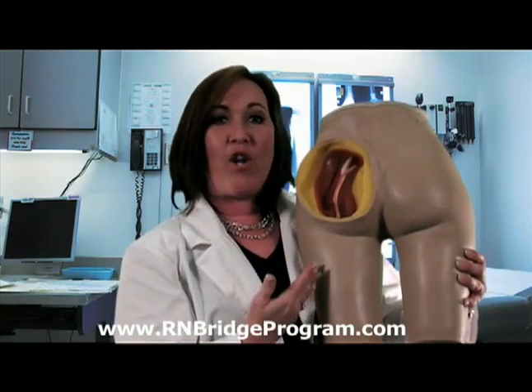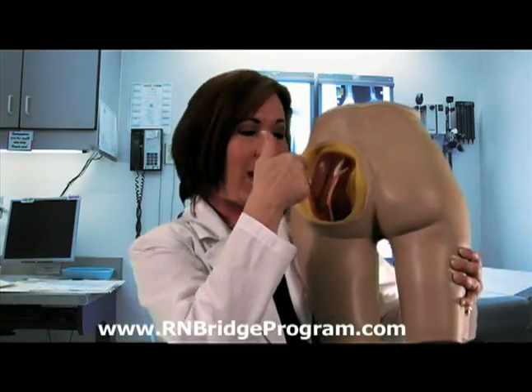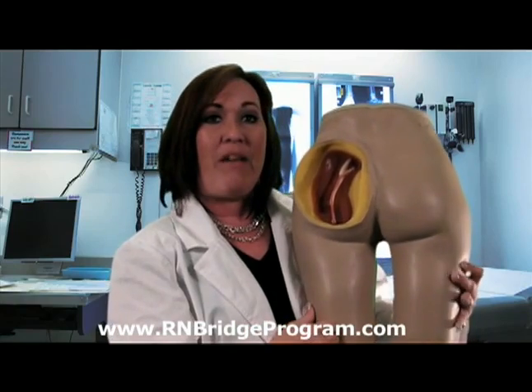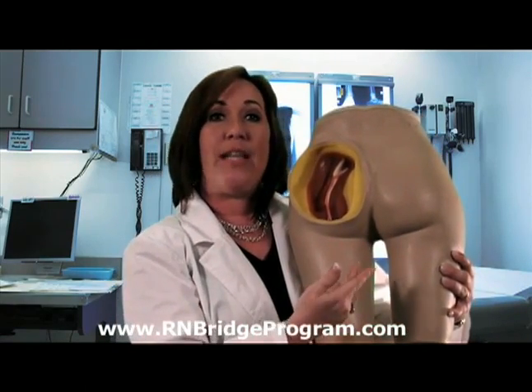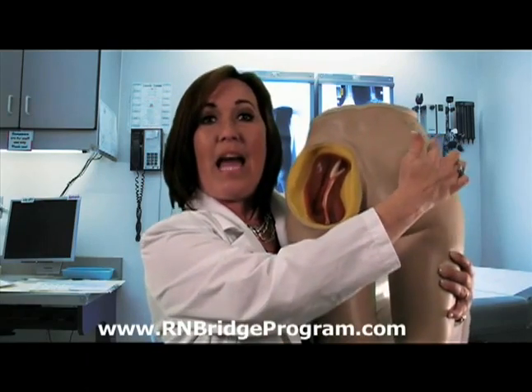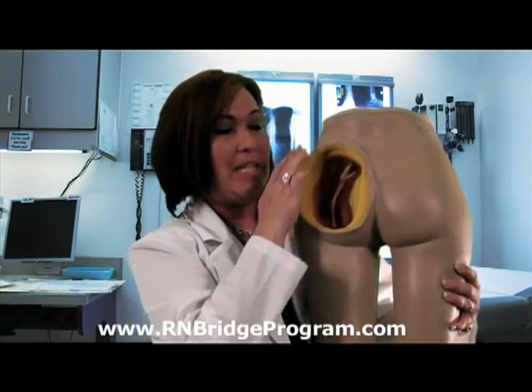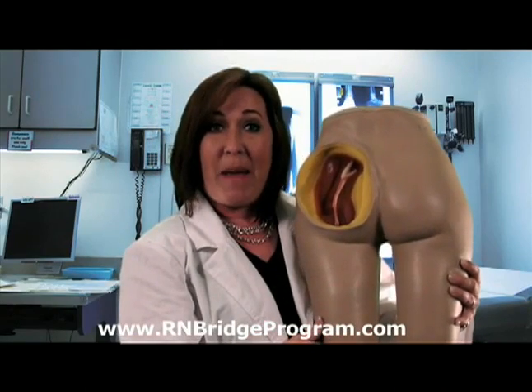Now when we find our landmarks for this patient, we want to make sure we're not going directly into that muscle because we're going deep and we don't want to hit that sciatic nerve. So the way that we find the appropriate landmark for this patient is we draw an imaginary line both vertically and horizontally, and then we're going in the upper outer quadrant or the upper outer aspect of this muscle, so that way we stay far away from that sciatic nerve, causing less damage to the patient.